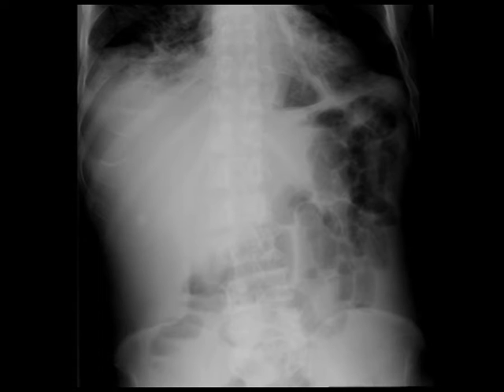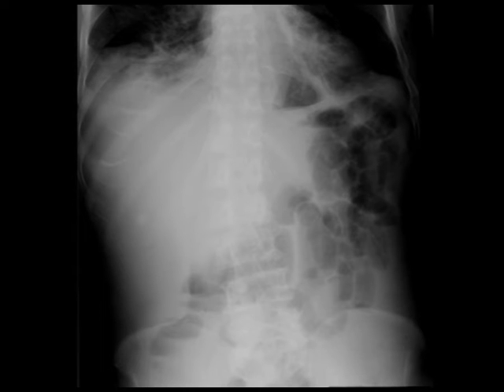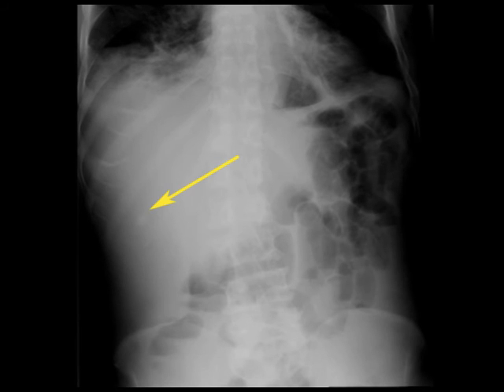This is a patient with enteritis. You can see that there's a lot of air within the small bowel and a few air-fluid levels. And if you notice that density in the right abdomen with the arrow, you might think that could be a gallstone based on location, or even possibly a kidney stone.